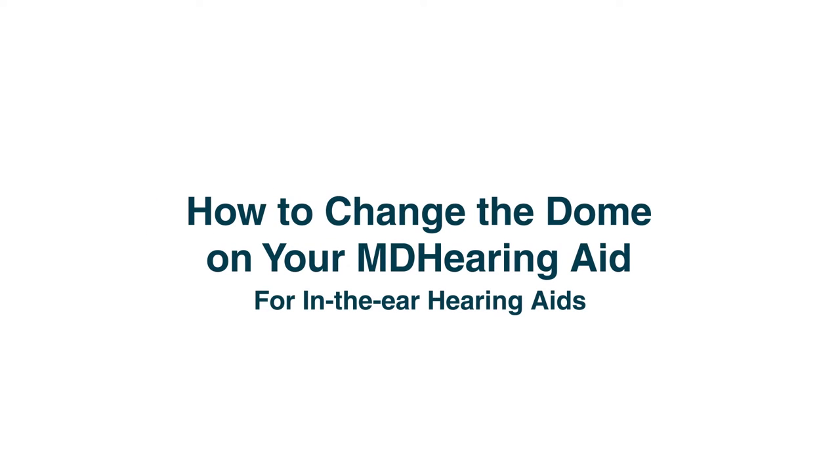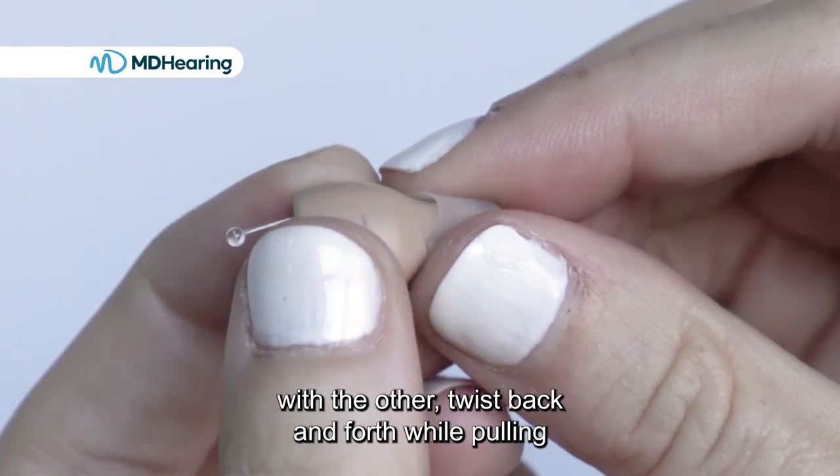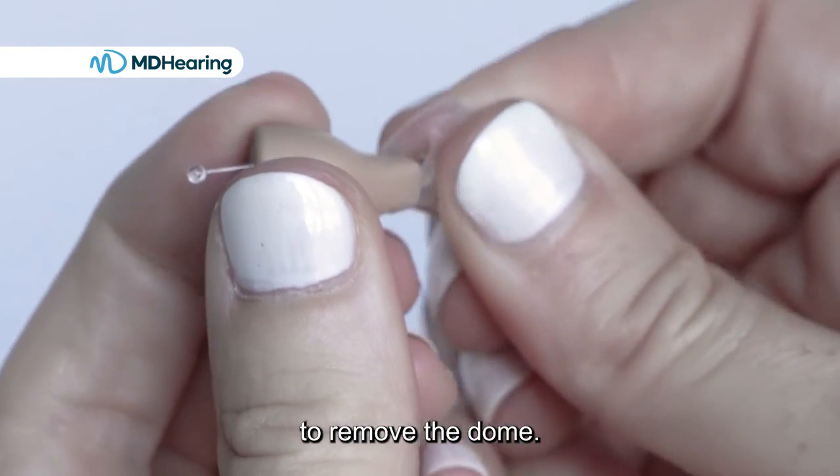How to change the dome on your MD hearing aid for in-the-ear hearing aids. Hold the hearing aid with one hand and grasp the dome with the other. Twist back and forth while pulling to remove the dome.